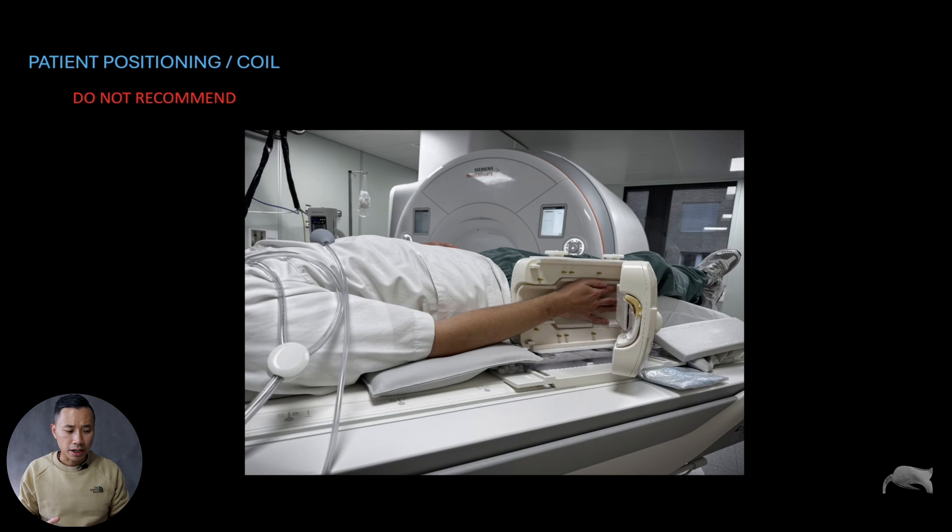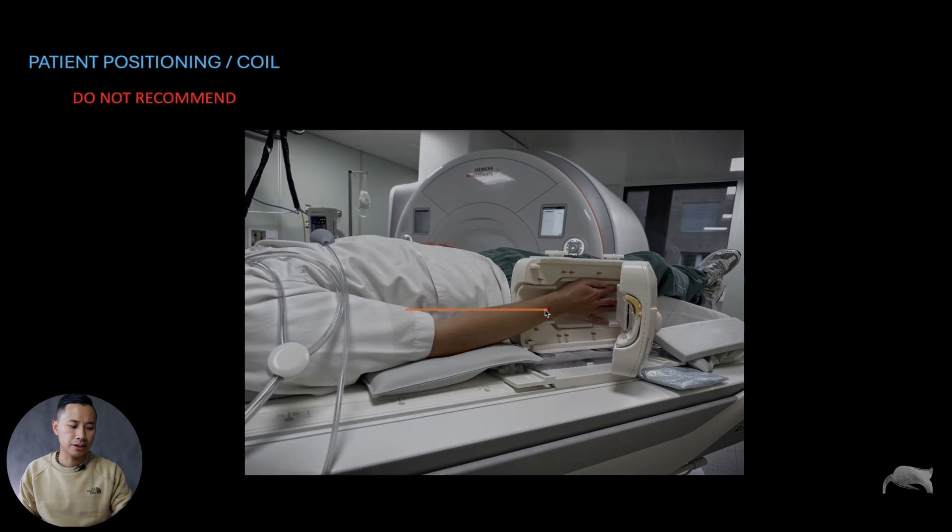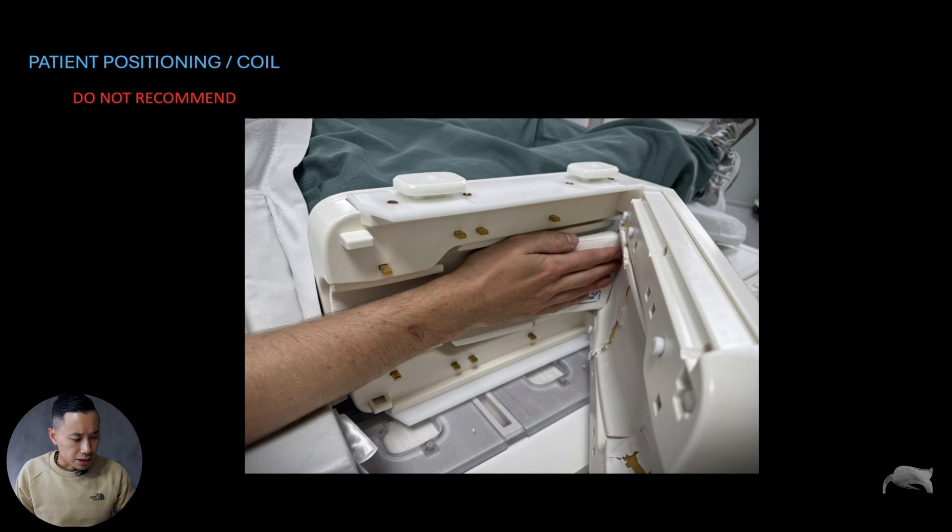What I do not recommend — it's not necessarily wrong, but it can make it harder to get good images. In this case the arm is not built up enough, so it's not 90 degrees — you have a curve there. The fingers are not close together, which gives you some challenges. You can see you should put some bags or something under the elbow to bring it up and achieve that 90-degree straight line.